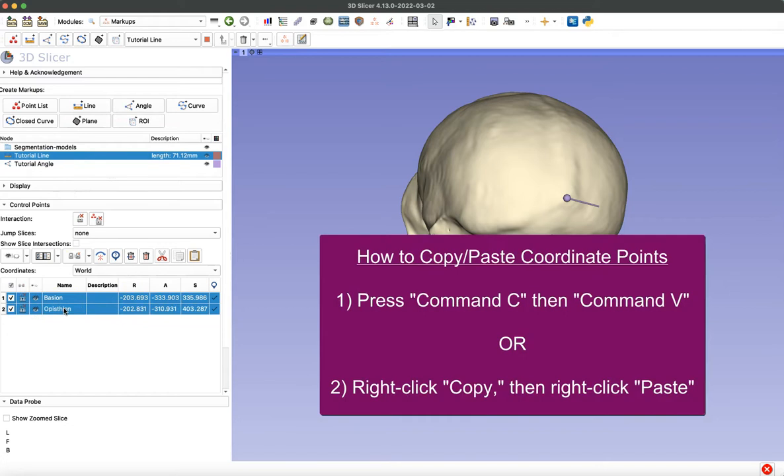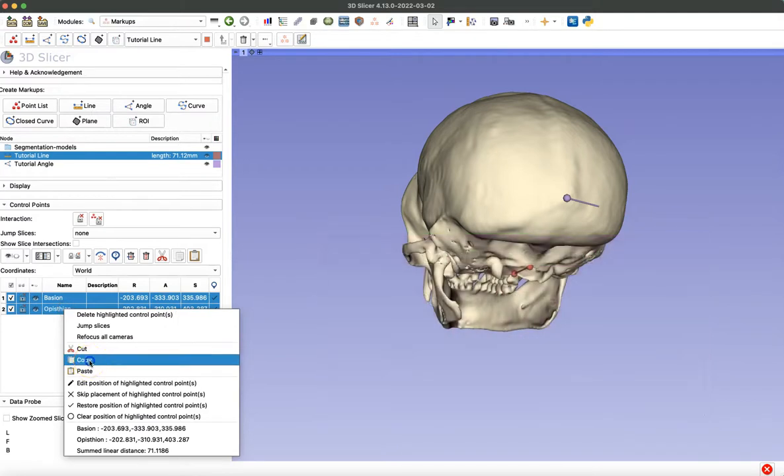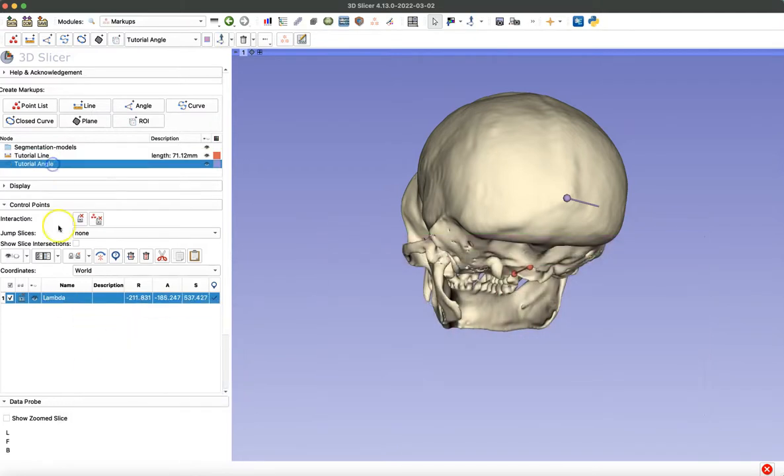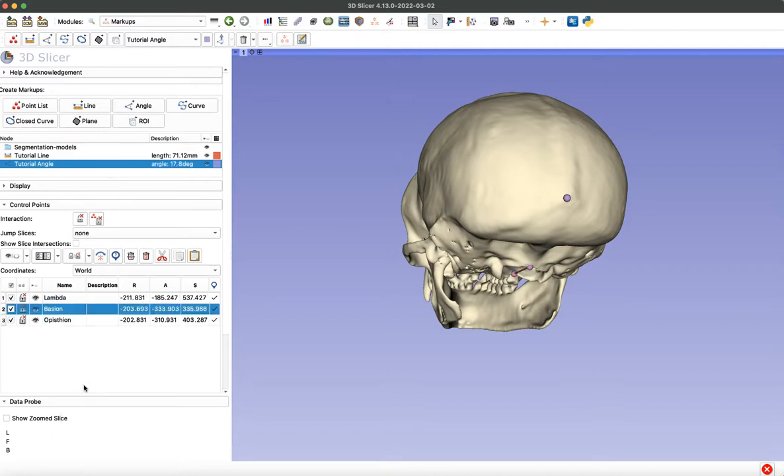So you can do that by pressing command C or by right clicking and selecting copy. Then we'll just navigate back to our angle, right click and select paste.